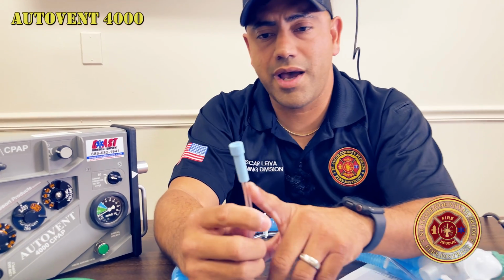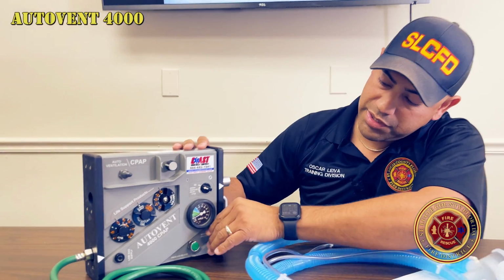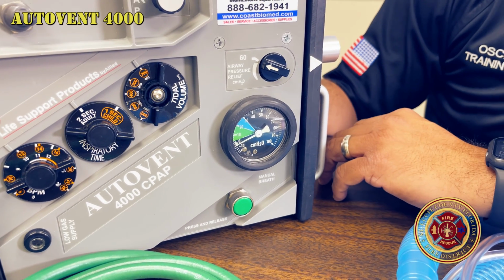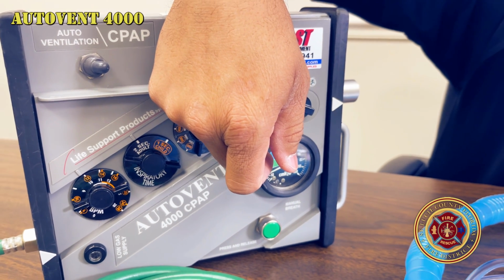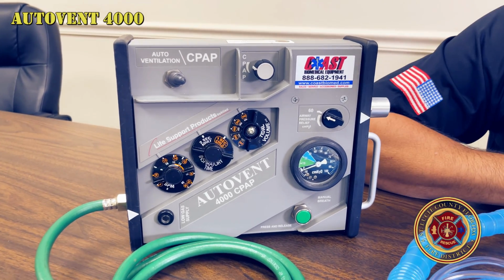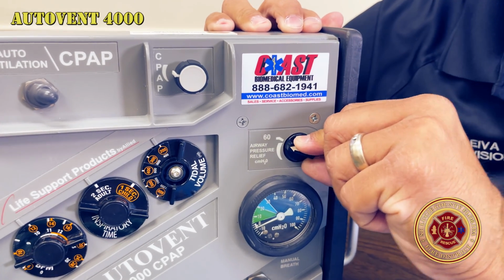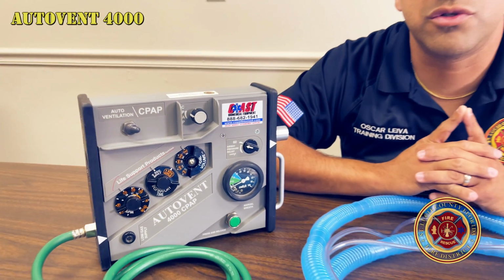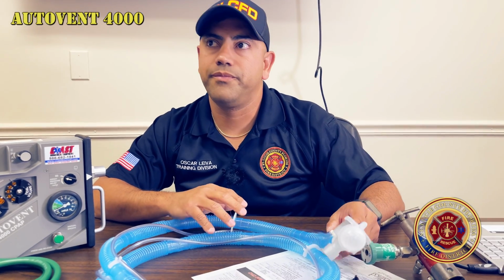Another feature you're going to notice is that it does have a pressure gauge reader. Basically what this does is read the pressure if there is any obstruction, and one of the ways you're going to see it is through this manometer reader. When oxygen is being delivered via the ET tube, iGel, or any which way you decide to do, when there is inspiration, you'll notice that the gauge currently reads 10, 20, 30, 40. Based on our pre-existing equipment, you want to make sure that when the air is delivered, you stay under 40, okay? The air pressure relief on this machine is currently set at 60. Just remember that if there is an obstruction of any sort in the delivery system, you will see that the dial climbs. At that point, you will need to reassess your patient and the system as well to make sure that there isn't any obstruction in the line during the delivery time.